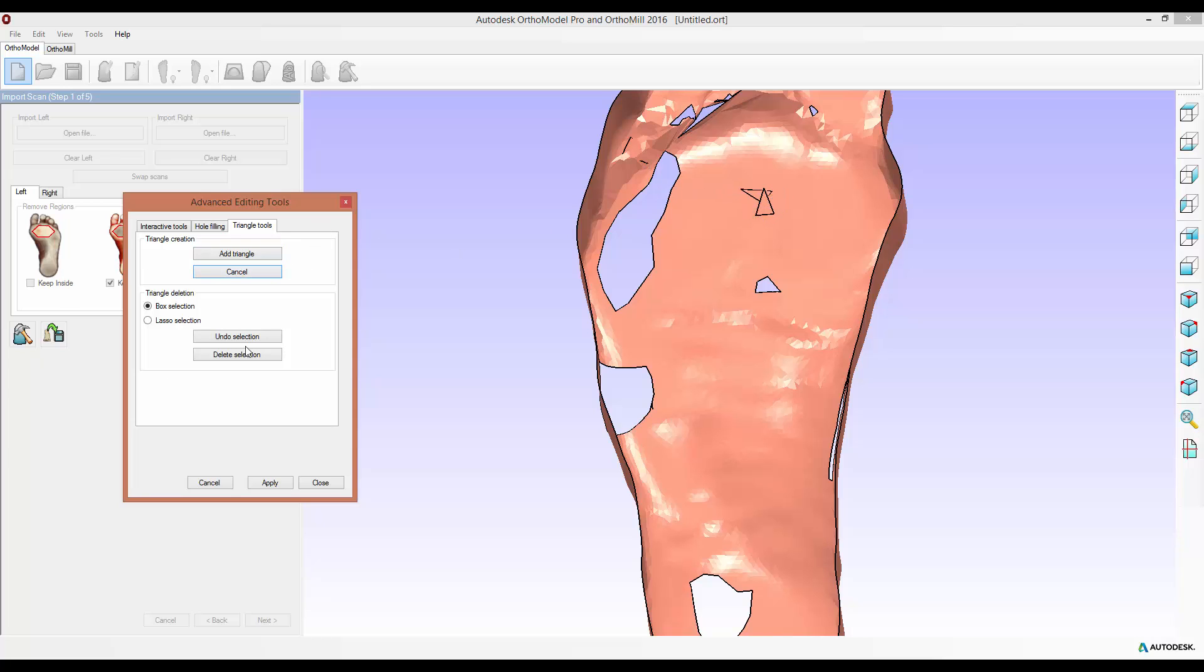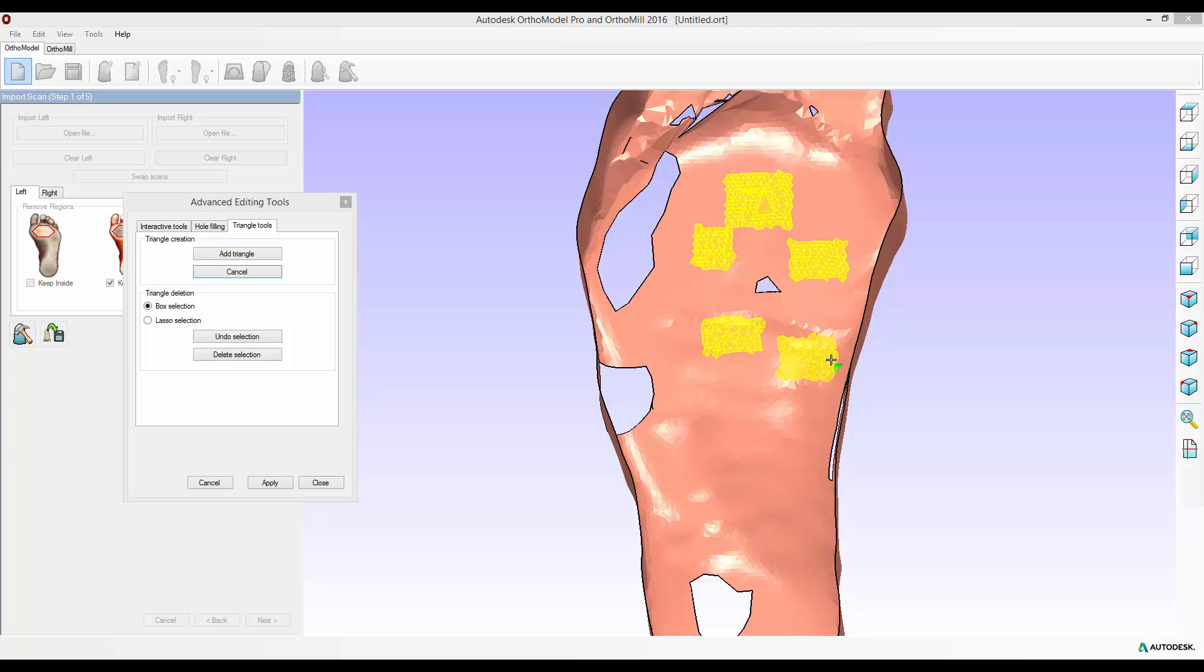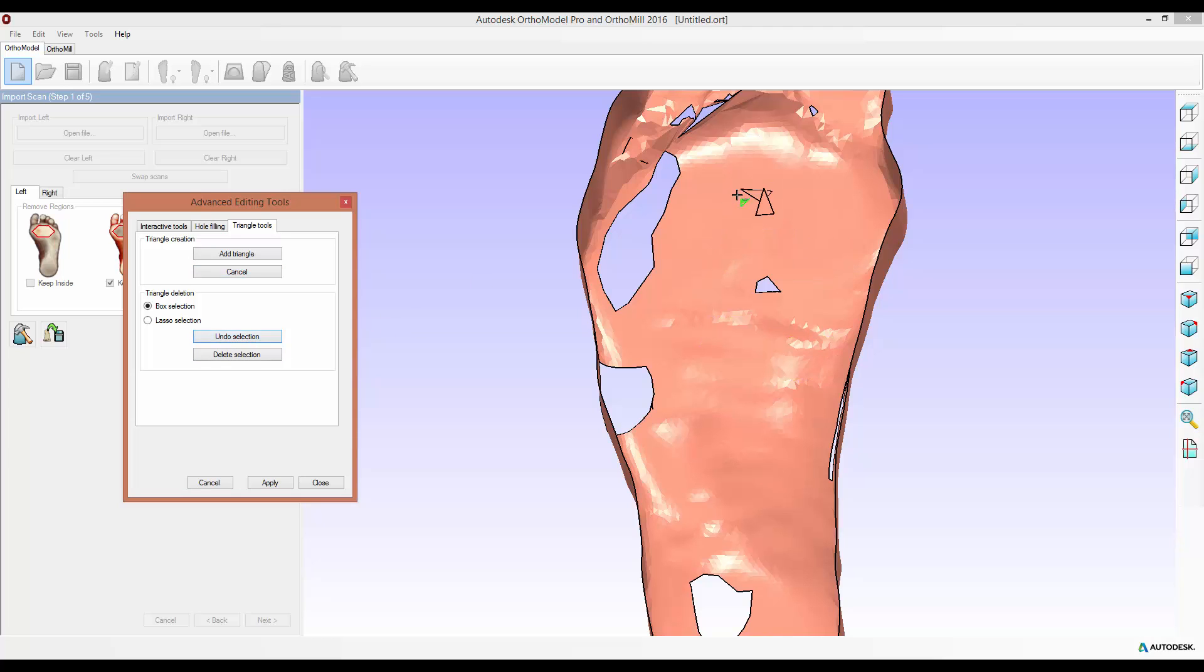Once you do this you go back into the selection mode and there's two types of selection: box selection and lasso selection. Box selection, which is the default, allows you to click and drag an area and it will select all triangles within that area. You can do this a number of times to add triangles to the selection. Once you've done this you can select delete selection to get rid of all the triangles highlighted yellow or undo selection to clear all of the triangles that are highlighted.